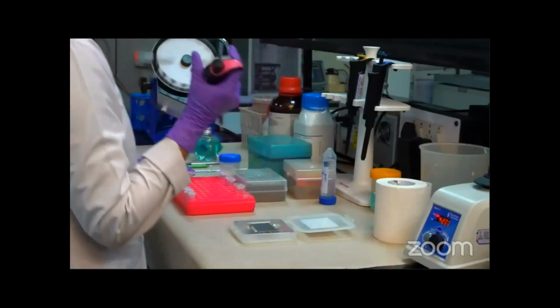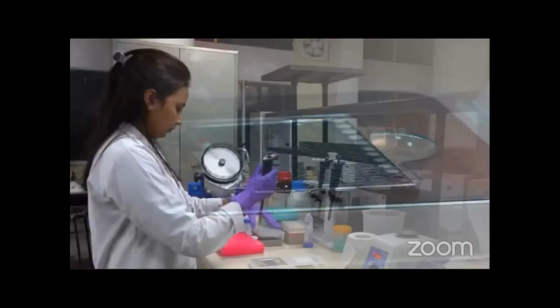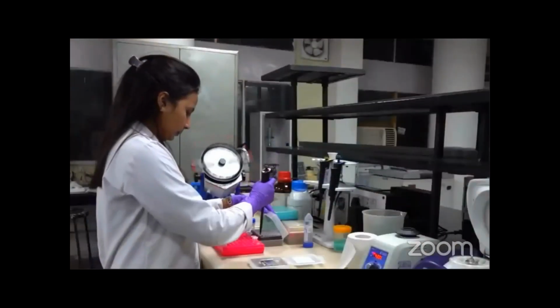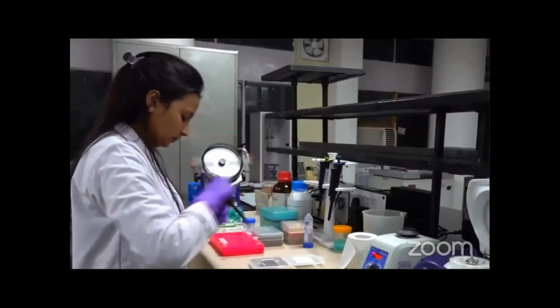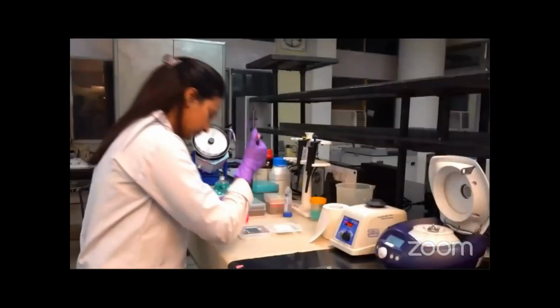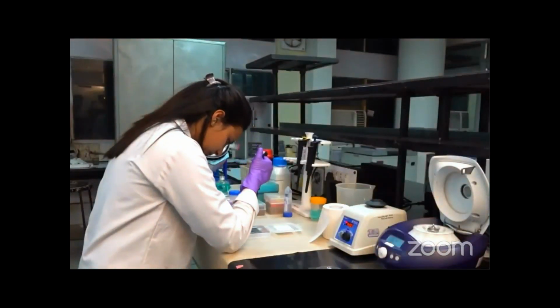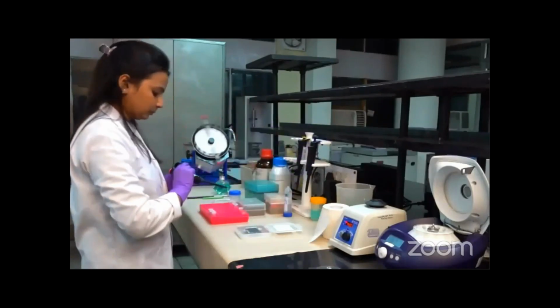Here is a spot close-up image on the MALDI plate. Now we add 1 microliter of formic acid on top of the dried yeast spot as standardized in our laboratory. Finally, we add 1 microliter of matrix on the dried spot before putting it into the MALDI machine for identification.